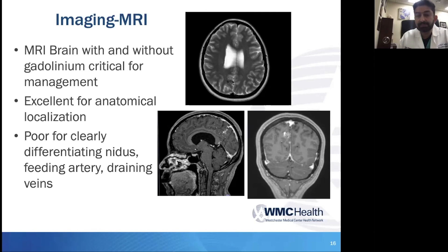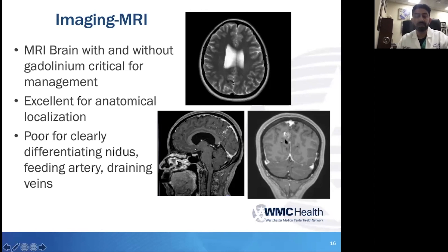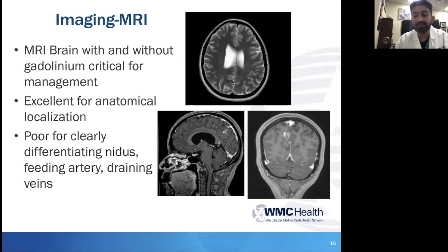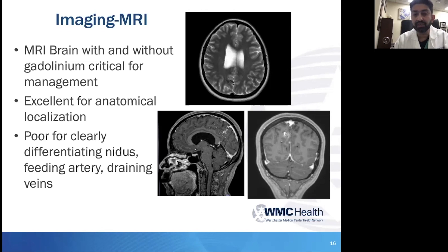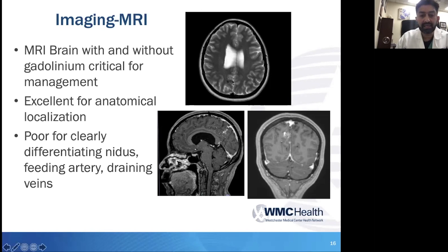These MRIs nicely demonstrate a parietal occipital junction AVM just adjacent to the midline and Falx. This is great for anatomical location and gives you an idea of eloquent versus non-eloquent. But as you can also see, it's not really great at differentiating where the exact nidus is, what my feeding artery is, or where my draining veins are — the three things that are important to delineate clearly as we're planning management.